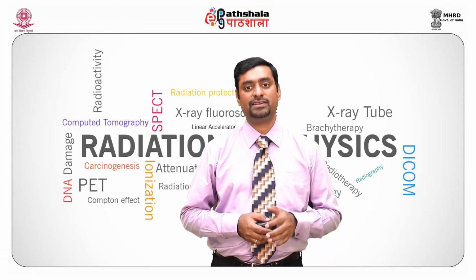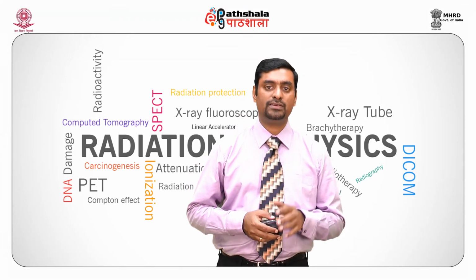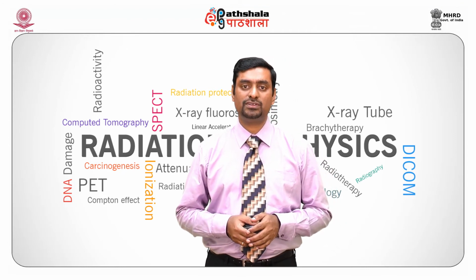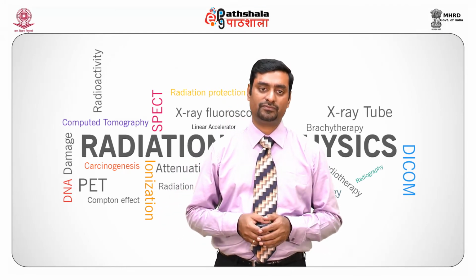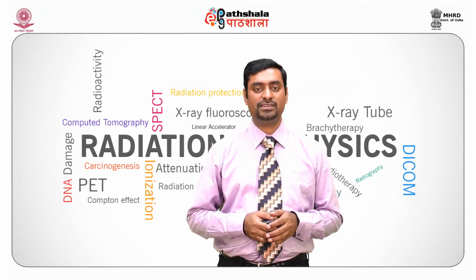As transmitted X-rays are absorbed in selenium, electron-hole pairs are produced. The number of charge pairs is proportional to the incident X-ray. This charge forms the digital signal used for creating the image.